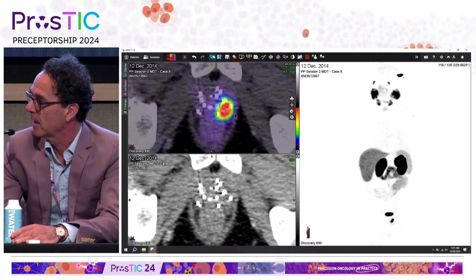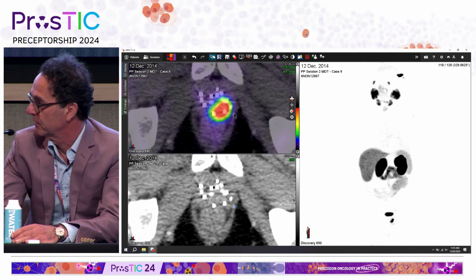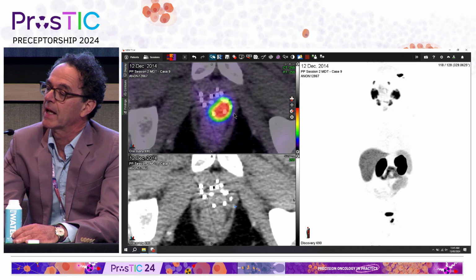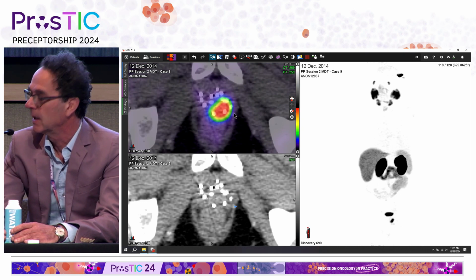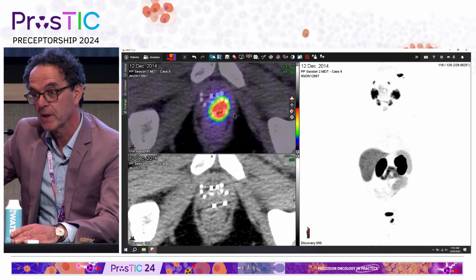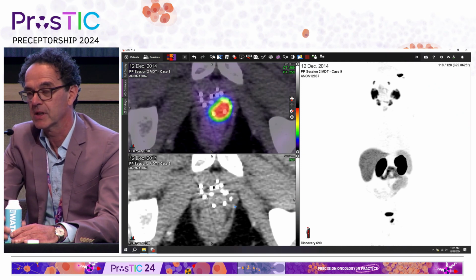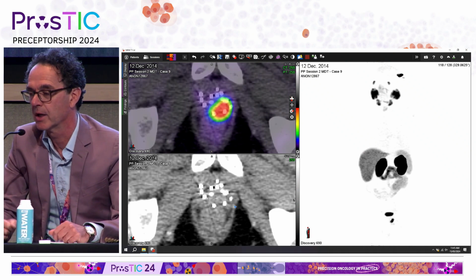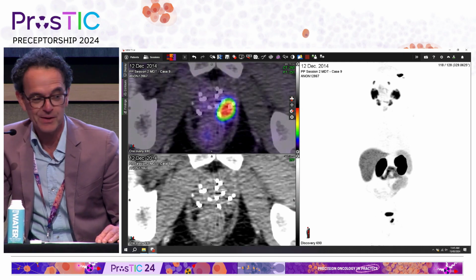But I would do that only in my trial, where we do a biopsy to confirm before we irradiate or re-irradiate, because we can cause harm. They have to have concordant MRI and PSMA PET as part of that trial, and it has to be less than half a lobe, because we're trying to limit the dose to the urethra. You can potentially cause fistulae and all sorts of very nasty toxicity with whole gland retreatment, which I don't believe in. But Dan might want to comment about whether this guy should have been treated in the first place.